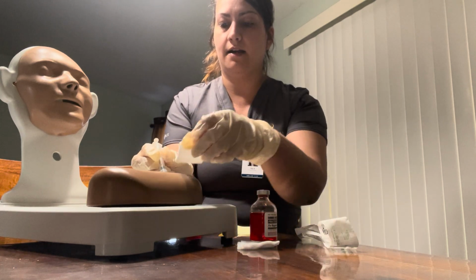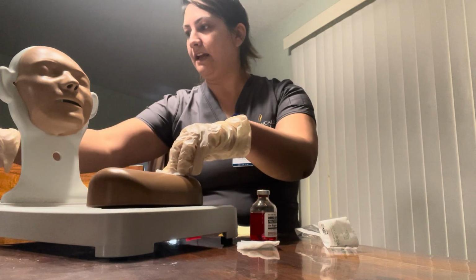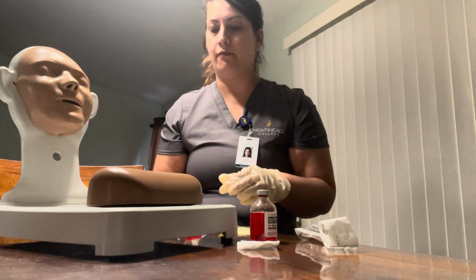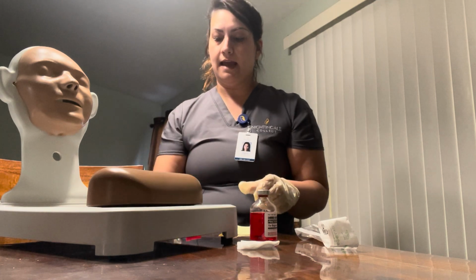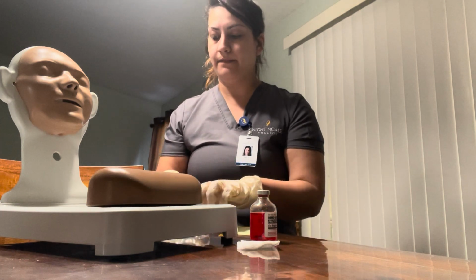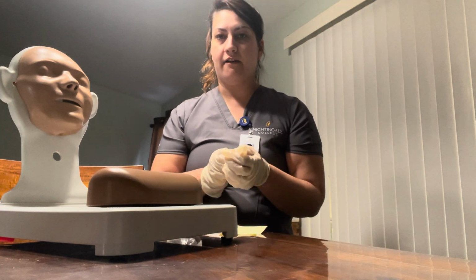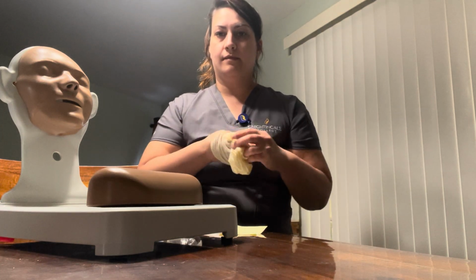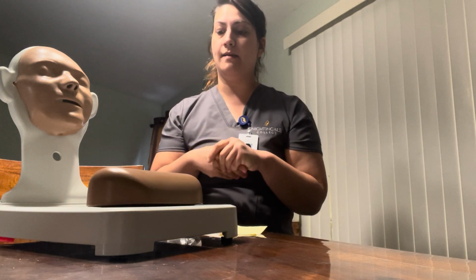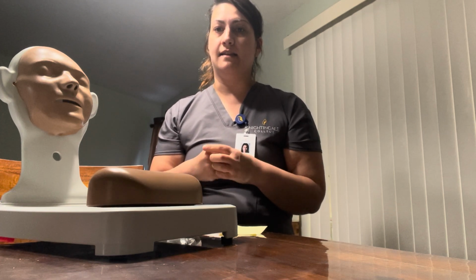And I will grab a gauze, and I will discard the needle in the sharps container, biohazard. I'll lightly press and take it off. I will put on a Band-Aid as needed. I will not recap my needle, and I will discard everything. I will take off my gloves and do hand hygiene, and I will go ahead and make sure that my patient is doing well. She has her call light, and I will document this in the computer. Thank you.